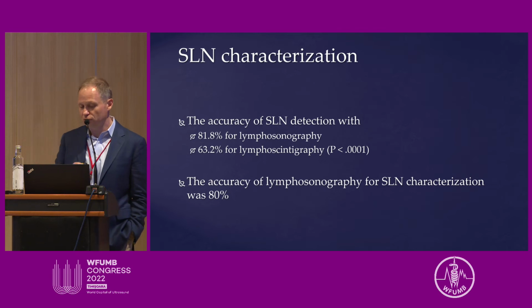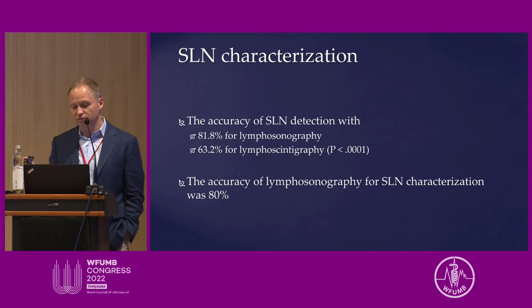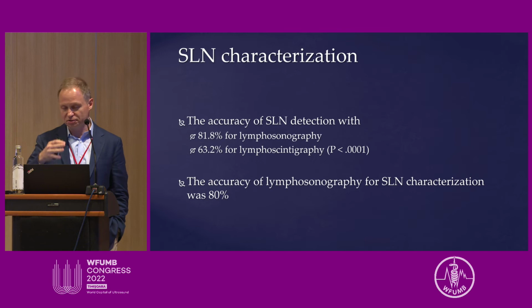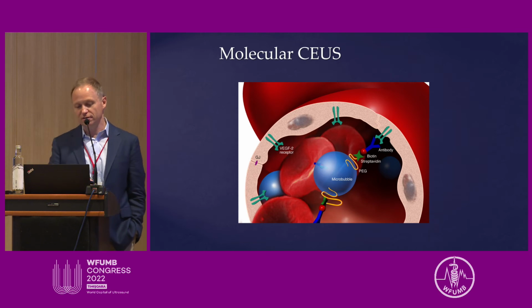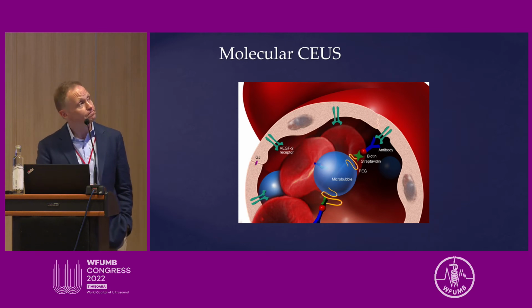And our surgeons told us to go away because they don't want to take 5 lymph nodes out per patient. It's just too much. So we said, okay, what can we do to characterize them? And we decided to try this new fancy thing of molecular ultrasound.